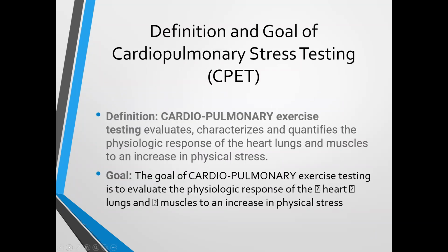So definition, goal of cardiopulmonary exercise stress testing. Again, there's various definitions out there, but they're pretty much all very similar to this. So cardiopulmonary exercise stress testing characterizes and quantifies the physiologic response of the heart, lungs, and muscle to an increase in physical stress.